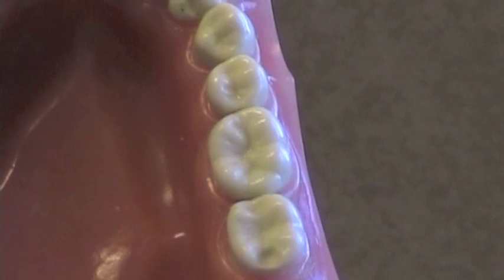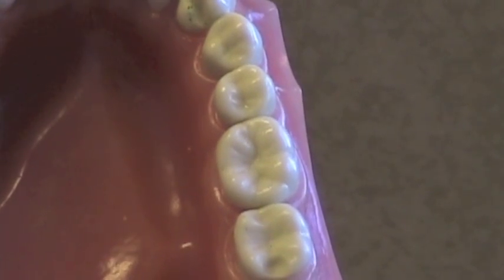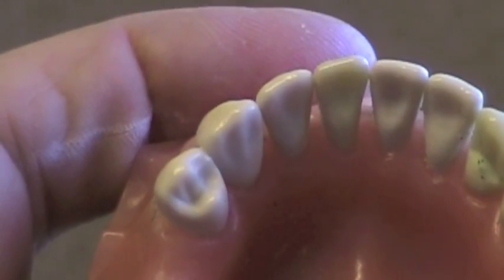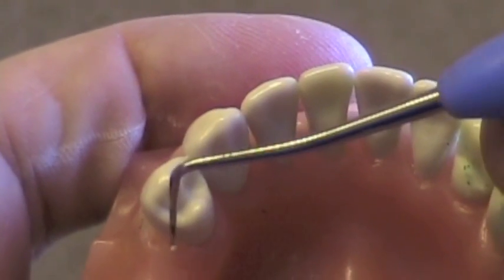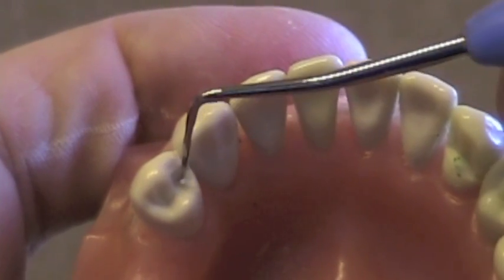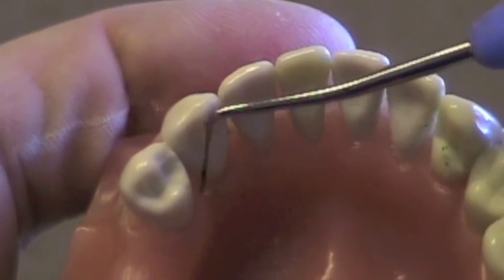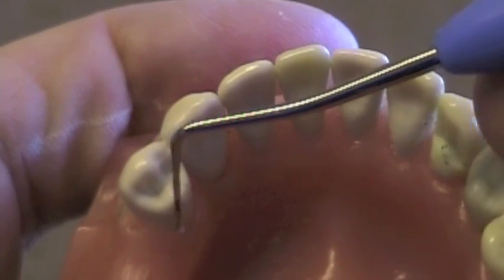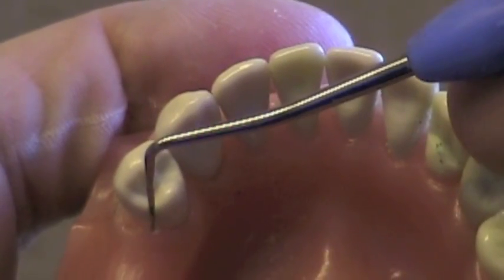It's important to try and minimize the amount of tooth that you remove in your preparations. There are some cases where I won't put a lingual bracing arm — for example, with a mesial rest where there'll just be a minor connector coming up there. In that case, we won't touch the lingual surface of the tooth.